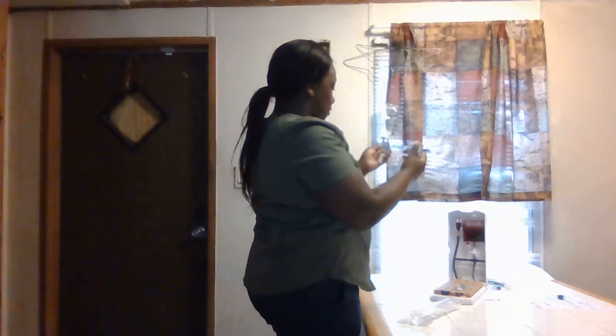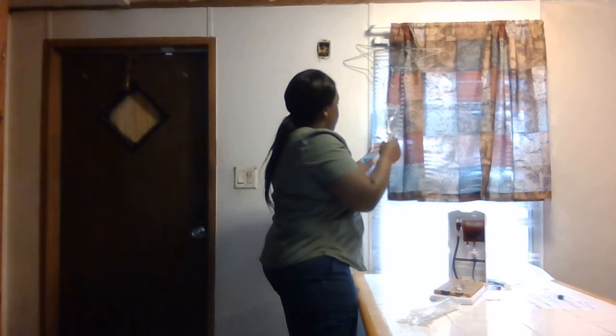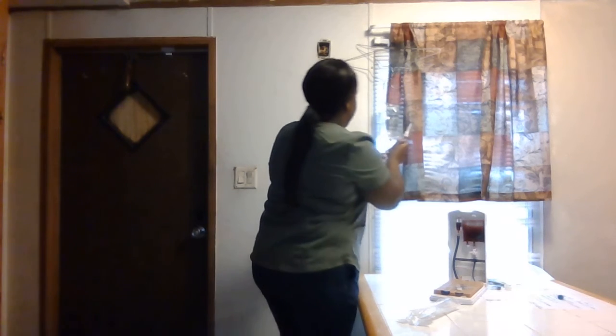Okay, and now this is the part where you have to really maintain your sterility. Trying to hold it right so that I'm never breaking sterility.